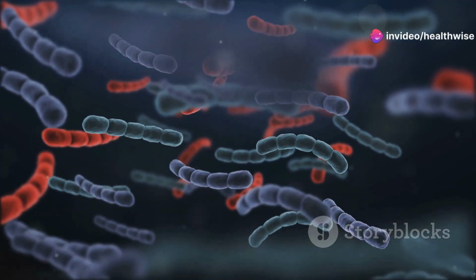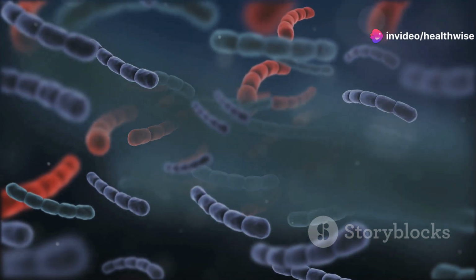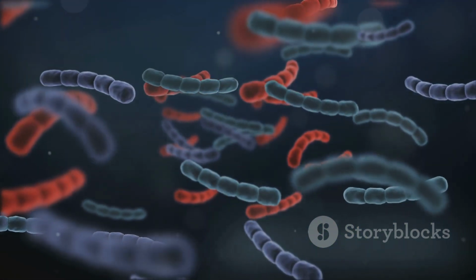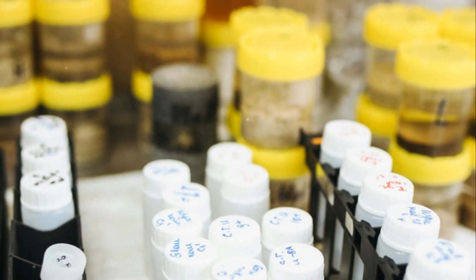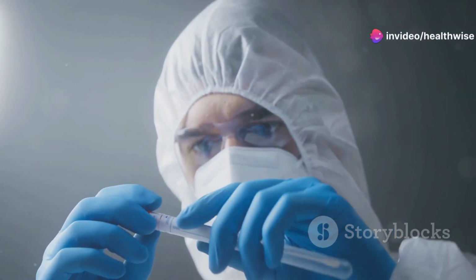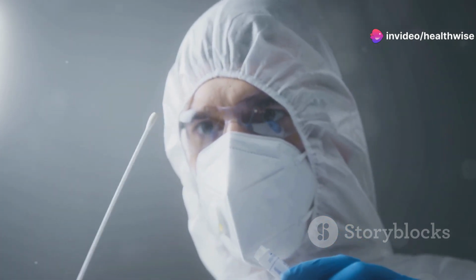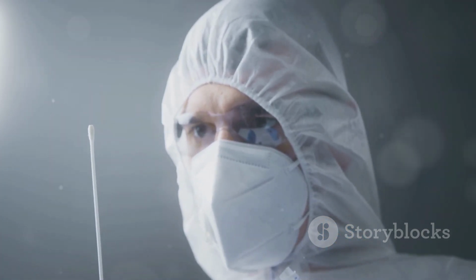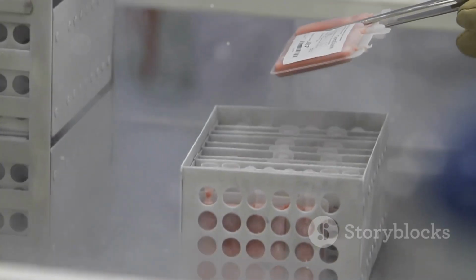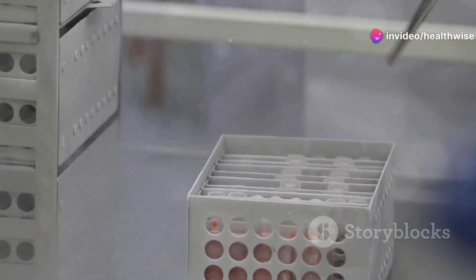For cultures of Mycobacterium tuberculosis, you'll need a series of 3 fresh, early morning specimens, each about 5 to 10 milliliters. This ensures that you have enough material for accurate testing. If the amount is less, advise your patient to collect sputum over 24 hours or until 50 milliliters is obtained. This might require some patient education and encouragement. Don't forget to refrigerate the samples to keep them fresh. Proper storage is essential to maintain the integrity of the specimen.